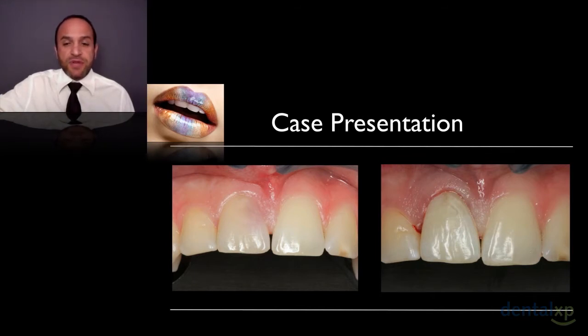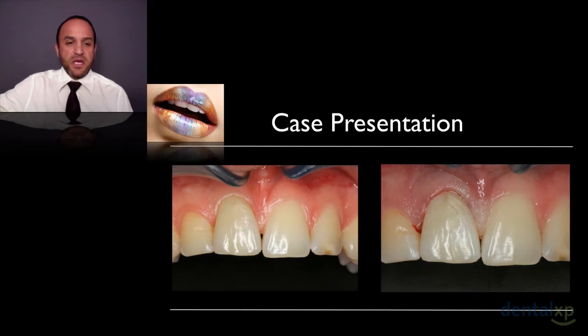And we basically retrofit the patient's own crown, whichever it is, whether it's ceramic, whether it's a ceramo metal, or the patient's own tooth, which is even more ideal. And we basically place the crown back onto the implant, retrofit it, to help stabilize the soft tissue around the papilla and the buccal tissue. You can see with healing, on this slide on the left-hand side, where there was a little bit of recession. And what we did to try and fix that recession was not do any grafting.